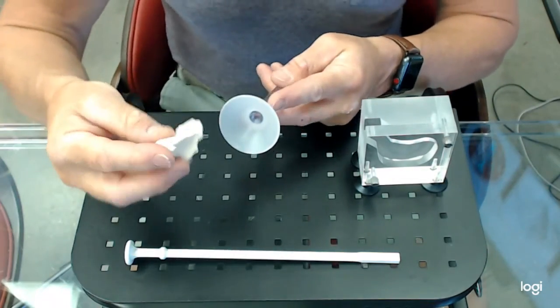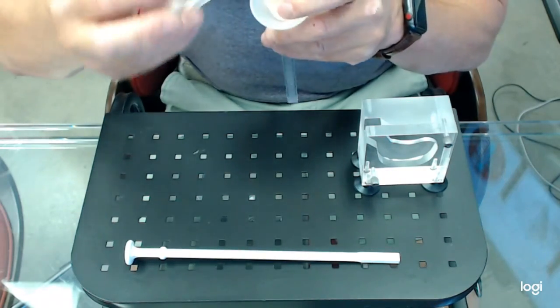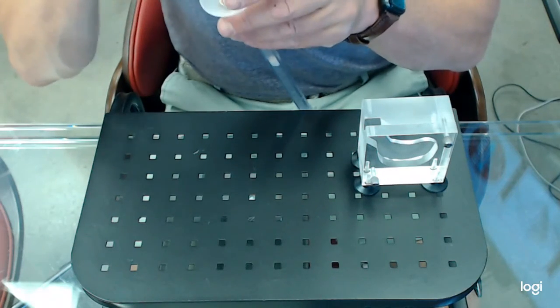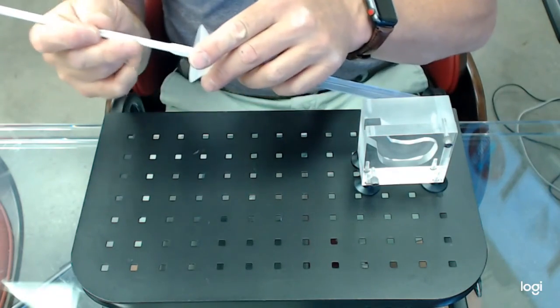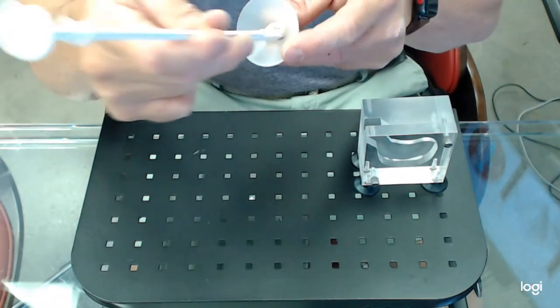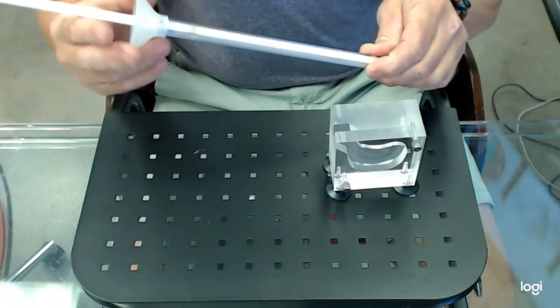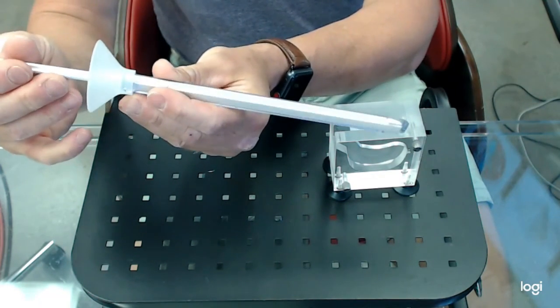So if this was the bone press bone, all the bone that's collected from doing the drilling, typically what you do is you would go ahead and fill it up and push it down until it fills all the way up. And this is a very standard procedure that's done. You do that all the way, and you keep on putting bone in until it fills the entire cannula, which is 10 cc's. All right, so at this point now I filled up the entire chamber. It's going to be roughly 10 cc's.